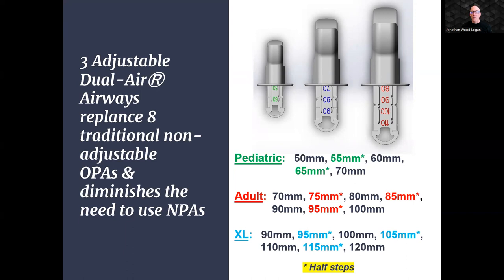With the NuZone Dual Air OPA, you can achieve more with less. Three of our adjustable airways can replace eight traditional non-adjustable OPAs. This simplifies inventory management, speed of selection, and reduces overall cost of airway devices. Our innovative design also reduces reliance on nasopharyngeal airways, thus streamlining the airway management process and enhancing patient comfort.